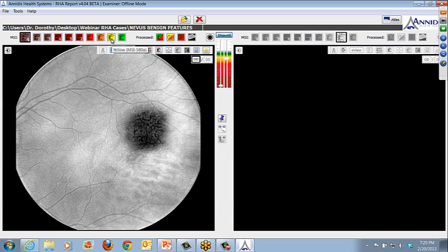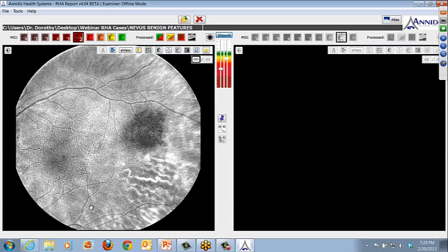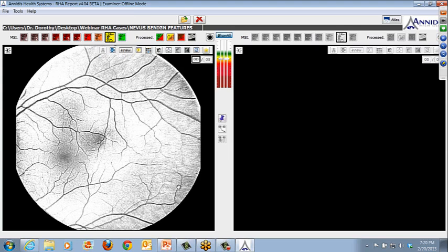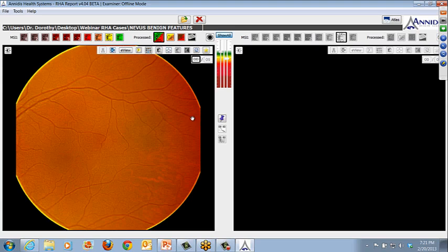So it's a highly persistent, consistent lesion. Nice smooth borders. It's in a location that is sort of on the edge of the high-risk area, right? The most high-risk areas are juxtapapillary and posterior pole. If you look at the yellow and the green, so these are a little hyperreflective here, but you want to look at this level to see if there's overlying drusen, and you want to do a clinical exam and at least reference your color image and look for overlying lipofuscin, right?